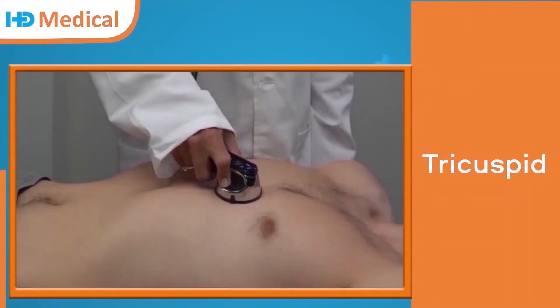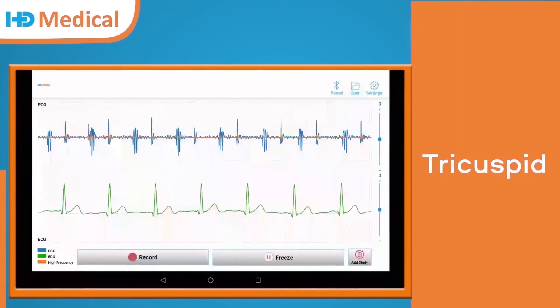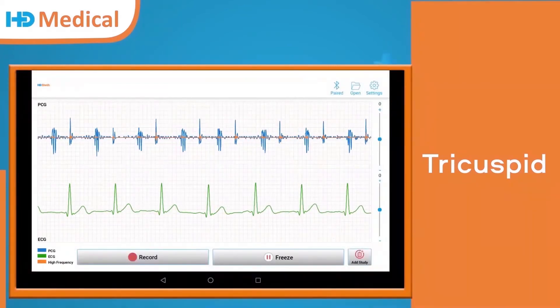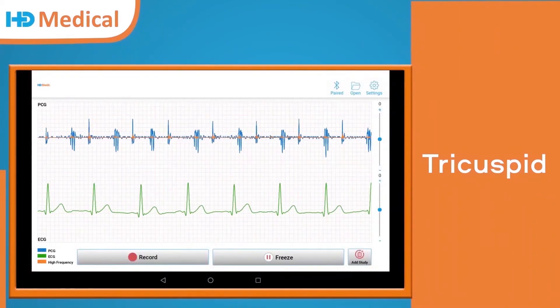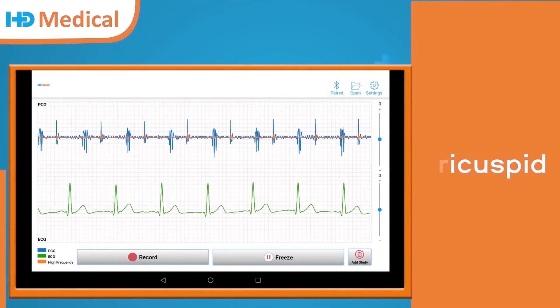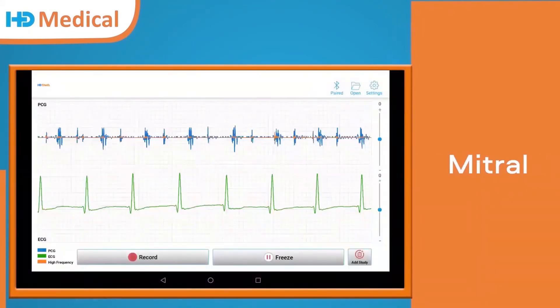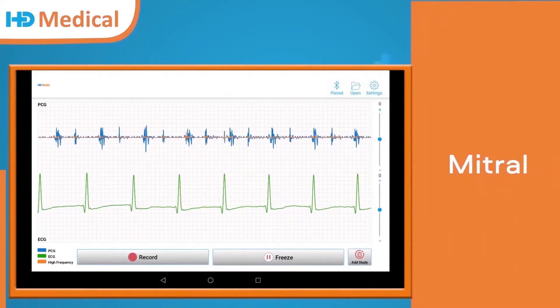The third position is the tricuspid. Tricuspid waveform. This is the mitral position. Mitral waveform.